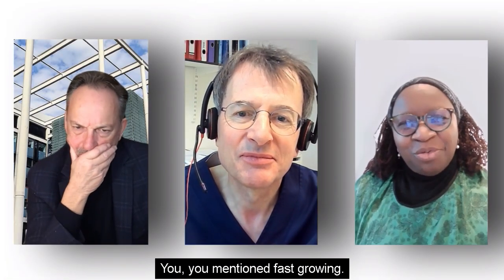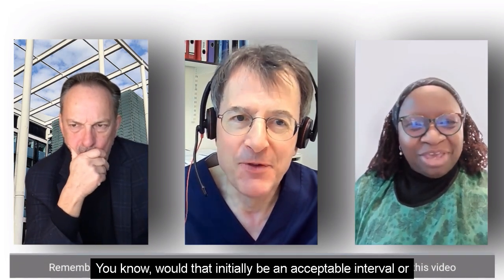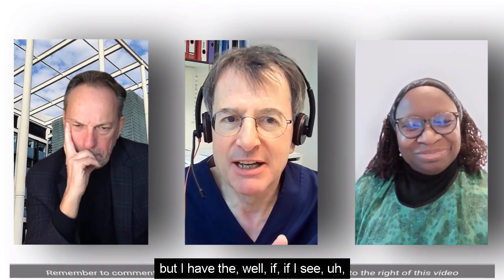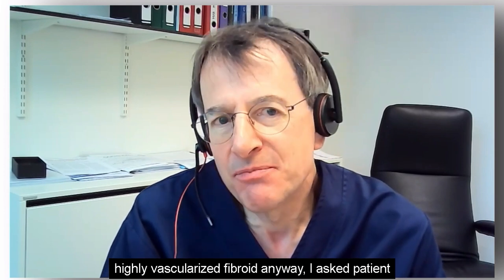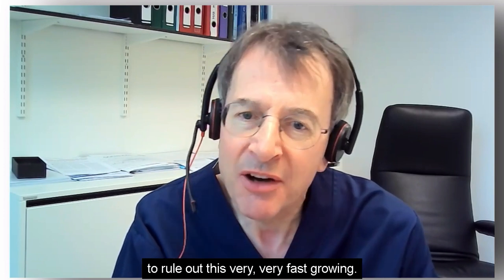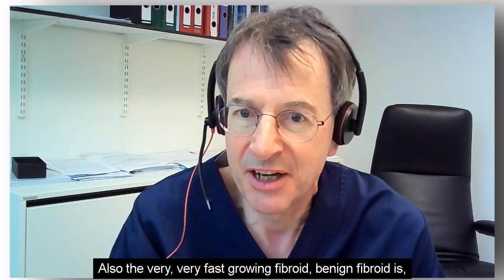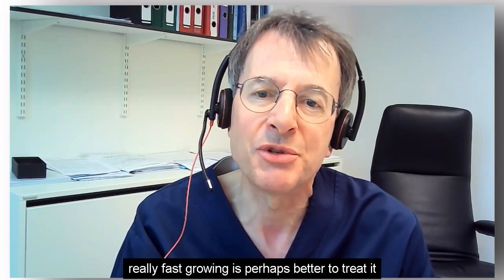You mentioned fast growing. What intervals should we scan at? Should we bring them back after 3 months? Would that initially be an acceptable interval, or is there no consensus? There is no consensus, but if I see a highly vascularized fibroid, anyway, I ask the patient to come back in 4 months, just to rule out these very, very fast growing ones. Also, if it's a very fast growing benign fibroid, it's perhaps better to treat it before it's too big.